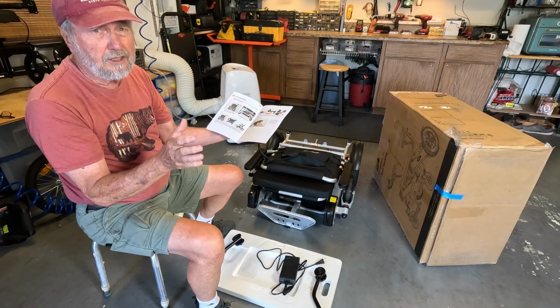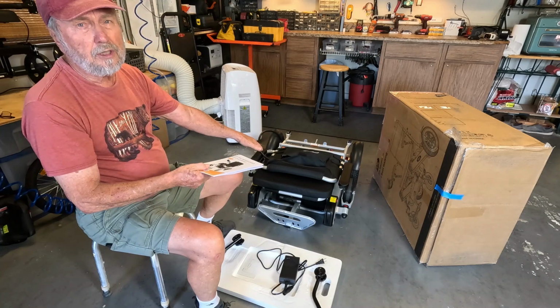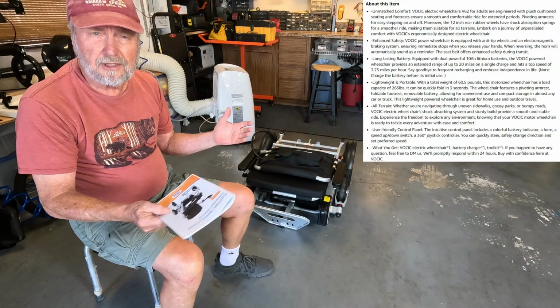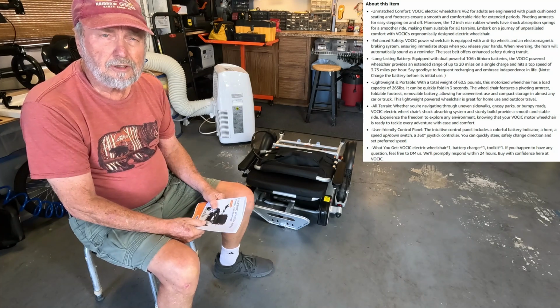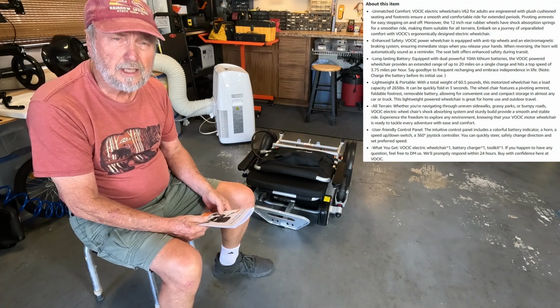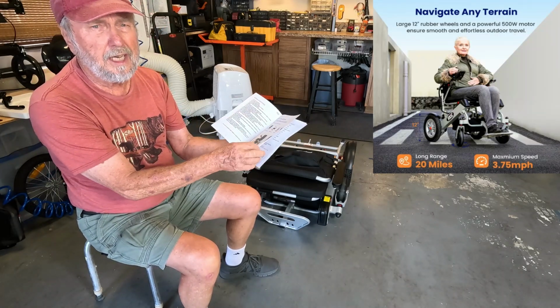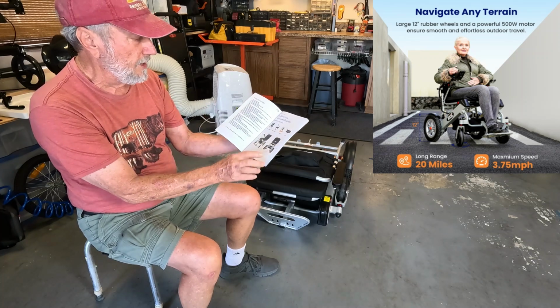It's already pre-assembled. It's just that you have to get it from the folded position to the unfolded, and we're going to show that. Now we're going to proceed with the assembly. In the upper right hand corner you're going to see a lot of supportive information about the product as we go along. Alright, we're going to go through the manual. You should read this entire manual ahead of time. It's not a whole lot, but get familiar with some of the things in it.